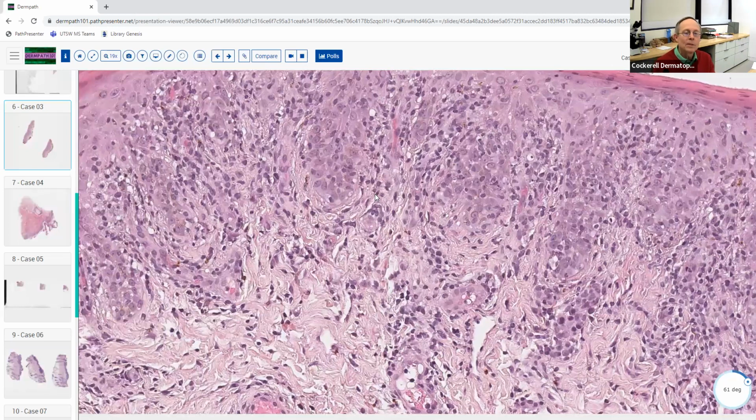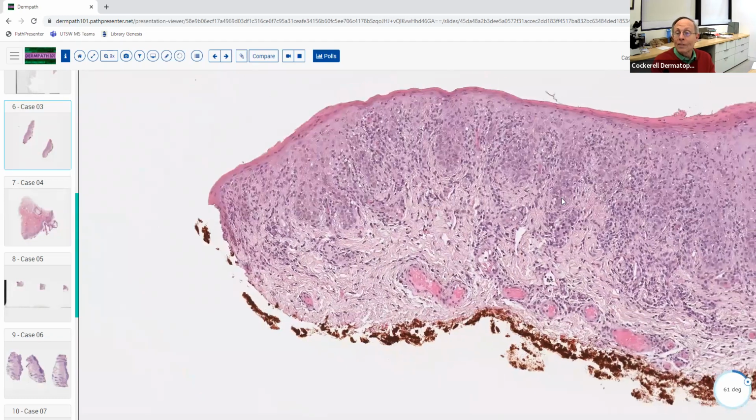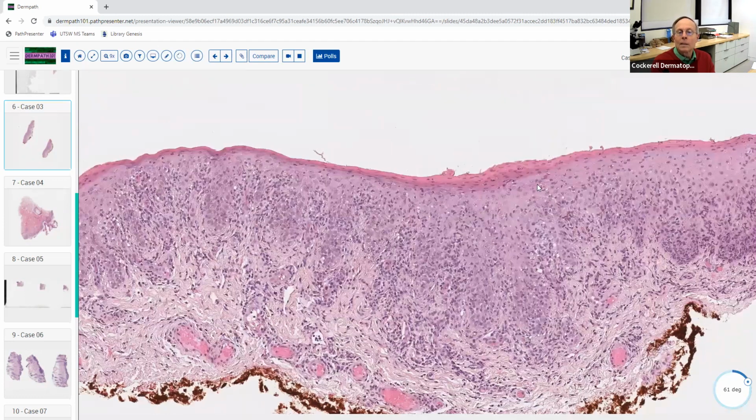I mean, I've seen some that, we've talked about, sometimes it looks like pityriasis rosea clinically. I've seen it look like pityriasis rosea histologically. I've seen it look like viral exanthem histologically. I've seen it look like vasculitis, like sarcoid. So it can look like a lot of different things. So that's a true statement, that syphilis can really take on a lot of different histologic pictures.